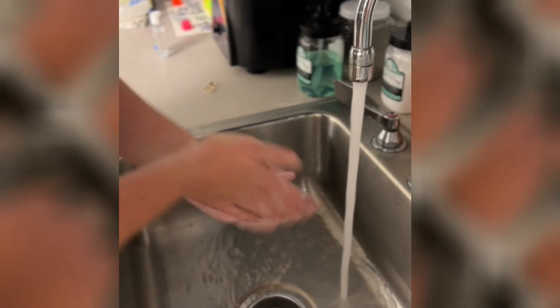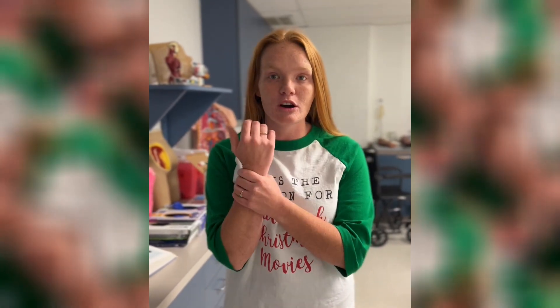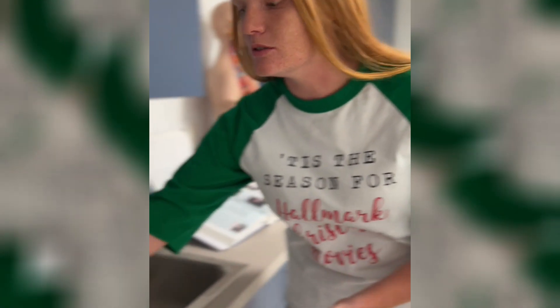I'm Brittany, a student at WVJC, and today I'm going to show you the proper technique to wash your hands. First, you have to make sure you don't have watches or jewelry on — we're going to take that off and lay it on the side of the sink.